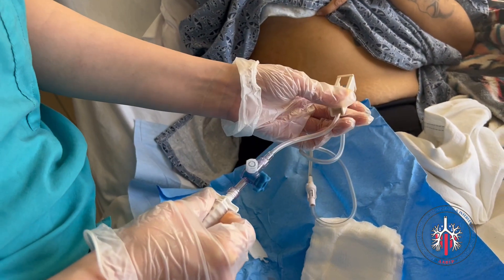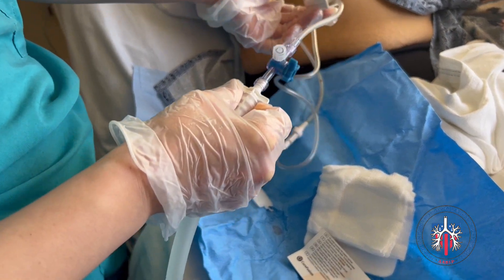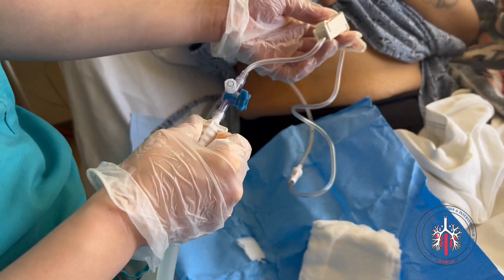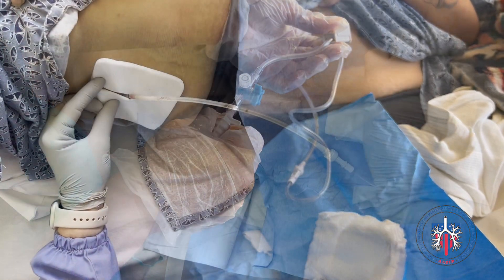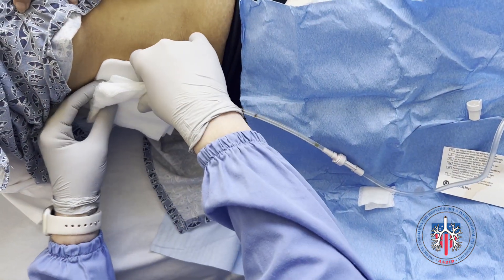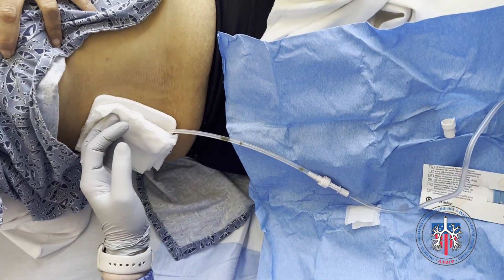Once connected, the dial on the drainage line is released from the locked position so that the pleural fluid can drain. Lastly, the pleural catheter is dressed with gauze pads and an occlusive dressing.